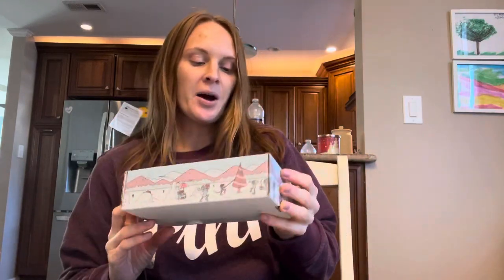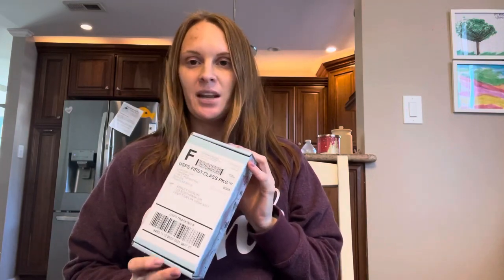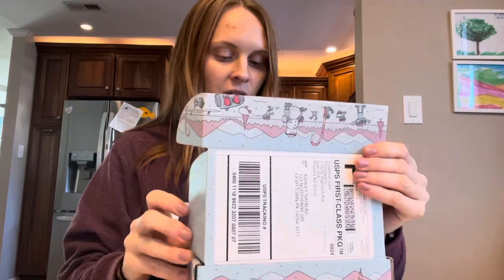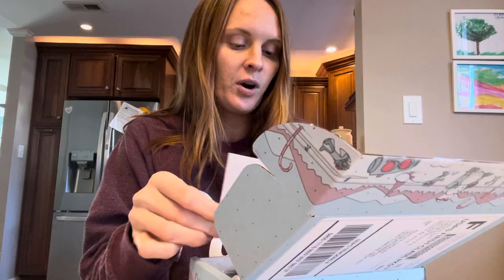Today I'm going to unbox and review these TheraSpec frames. I had these custom-made — I sent in my Ray-Ban sunglasses for them to put their migraine lenses in. I'm super excited about it because I really loved my frames, but they weren't doing enough for me.